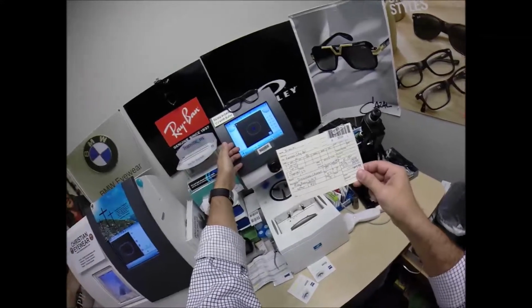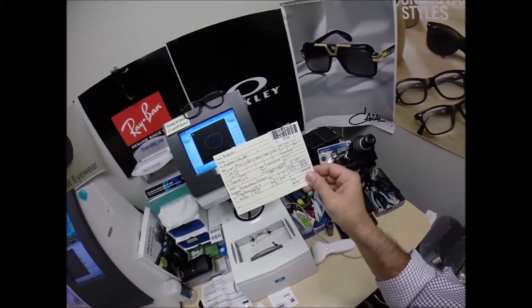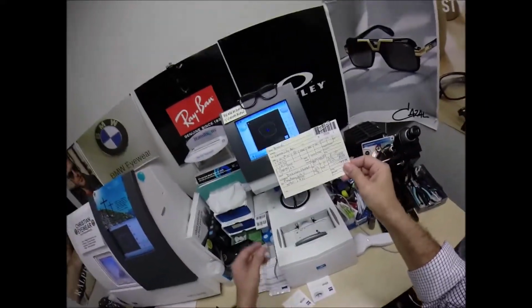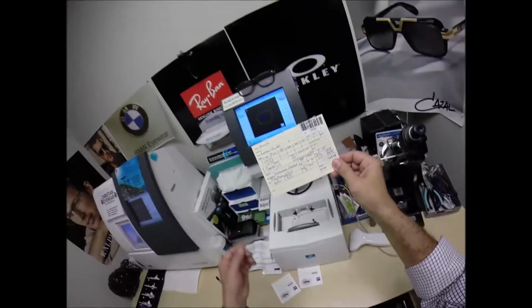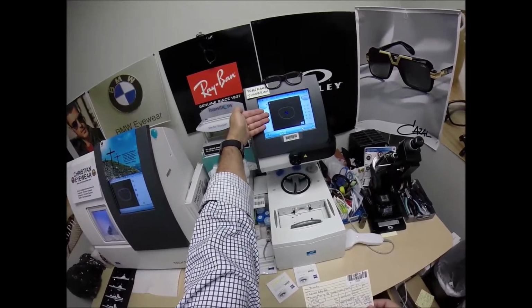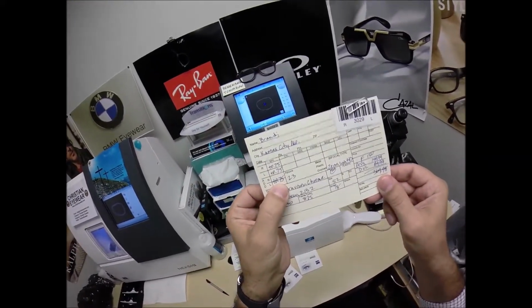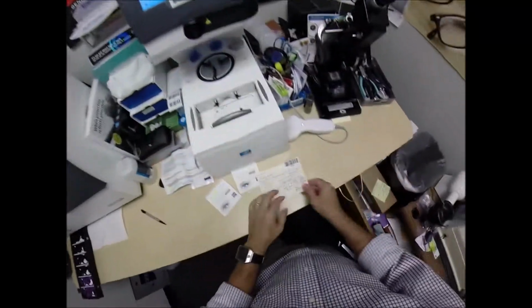Now, Brandi has great distance vision, but that 40-year virus is sneaking up on her. Now, Brandi's only 25, but she's ahead of her time. But she just wants to know what it feels like to be in her 40s, so I'm making her these glasses. So you need 3 steps of magnification to see at arm's reach. Now, she needs an additional 3 steps for a total of 1.5 diopters to see right here, the keyboard, any data entry.